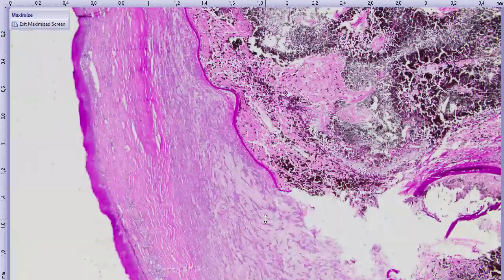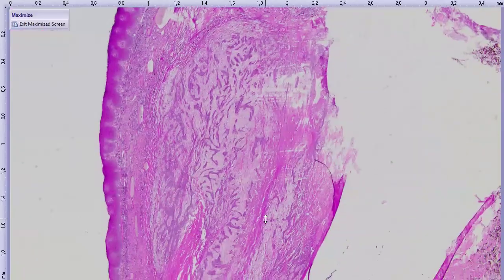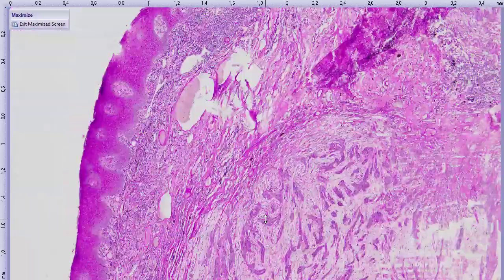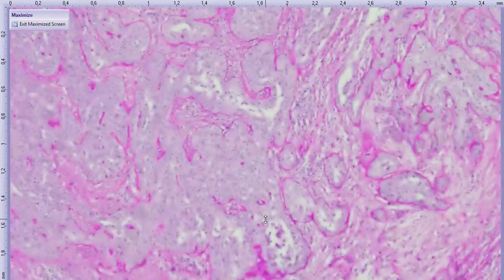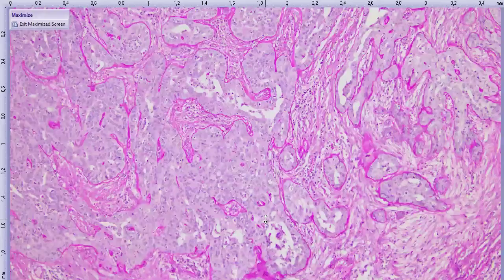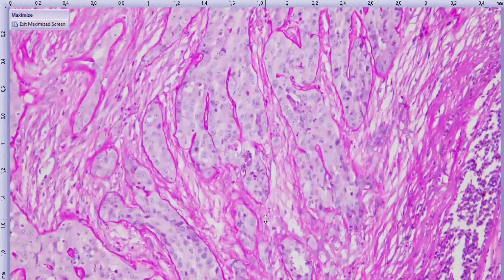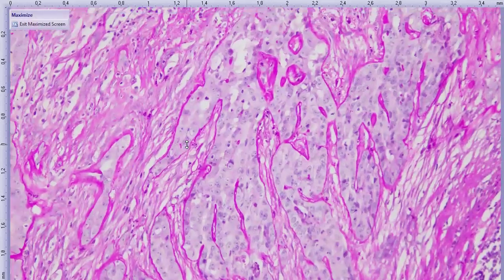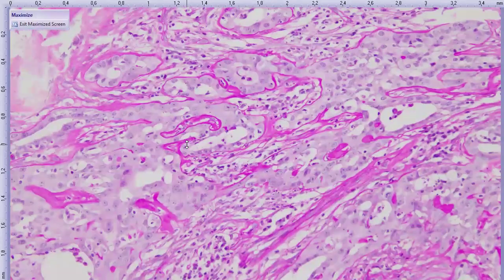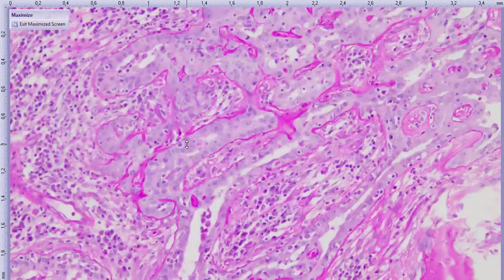To be honest, sometimes you order a PAS and then you come back and you get a little different look at it. But in this case, we thought it was very useful because you can see this classic epithelial population of cells, and it's showing pretty neat looking basement membranes. These are very thick, irregular basement membranes, like we see with iridociliary tumors in the eye, right? We were kind of happy with this population here being epithelial.